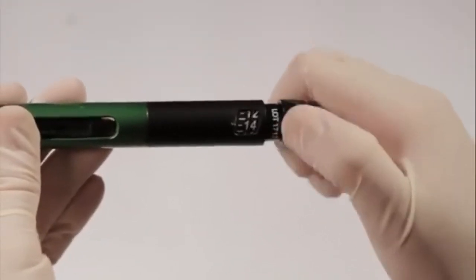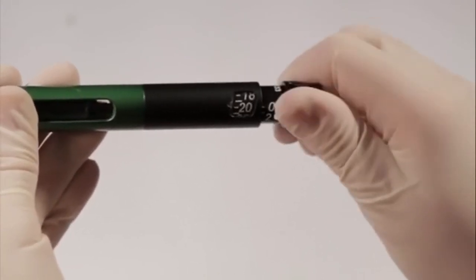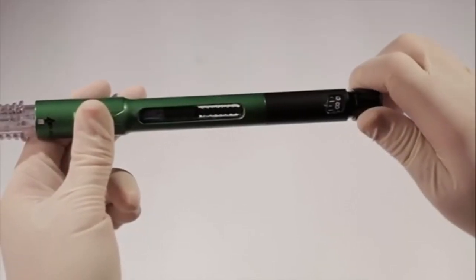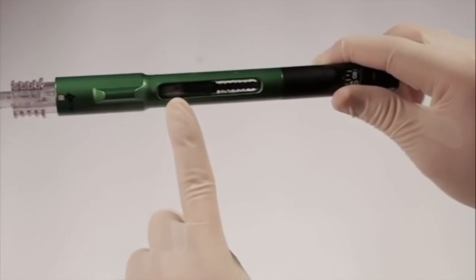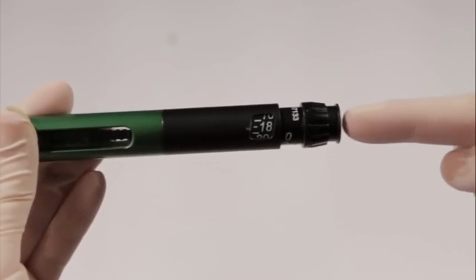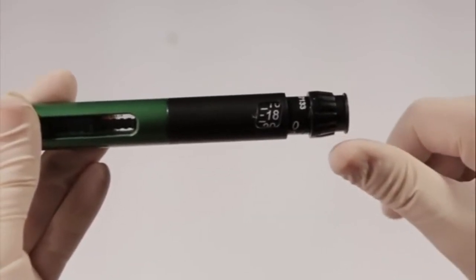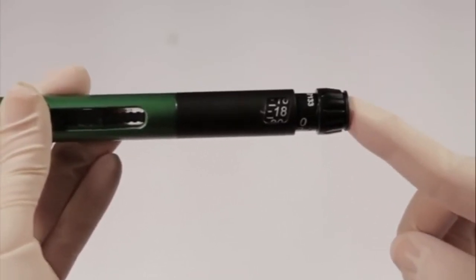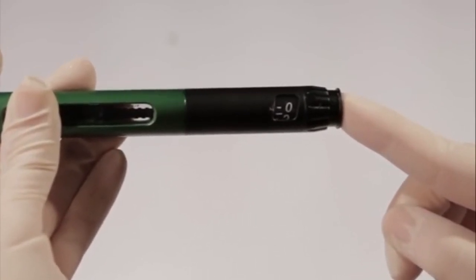If you find yourself in a situation where you have dialed the wrong volume — either too high or too low — you can easily correct this by turning the dial backward or forward to the desired volume, then depressing the button to mix as normal. If the pen will not dial all the way to the number you desire, this indicates the 3-milliliter cartridge does not have enough solution to mix the full amount, and you will need to replace the cartridge. It is important to push the dispensing button straight in without pressing against the rotating dial or at an angle. If the button will not depress smoothly or seems stuck, check that the rotating dial is not caught in your thumb or glove. You may also try tapping the top of the button to move it along. Never force the button in, as this may damage the pen mechanisms.